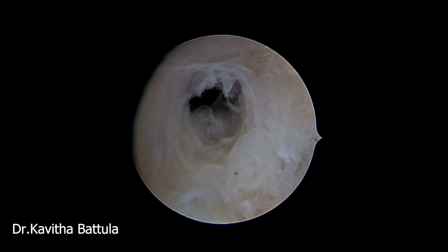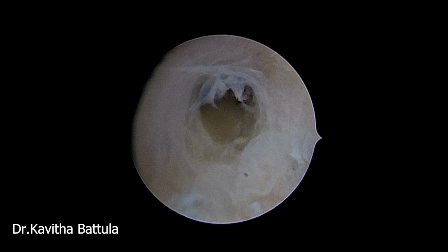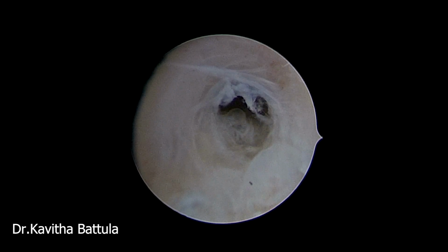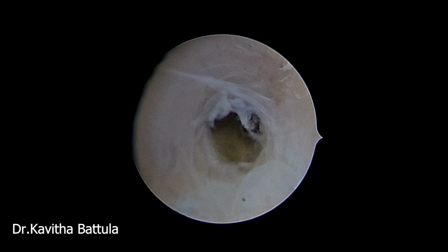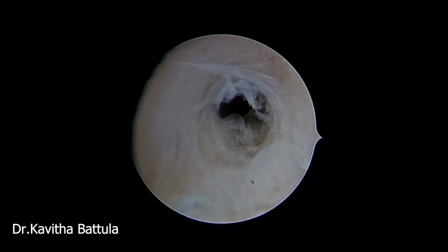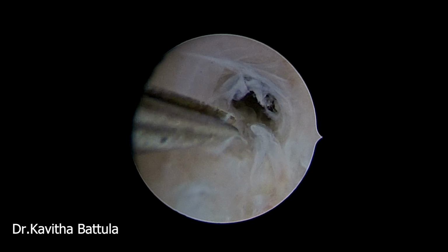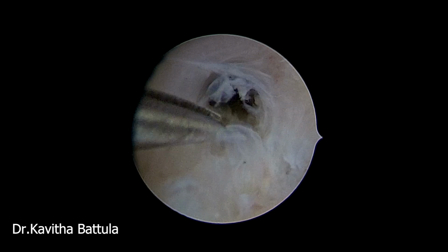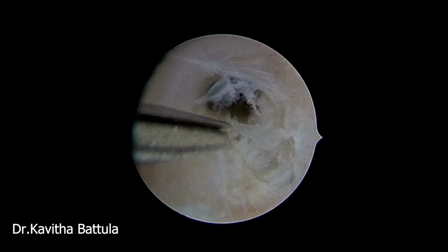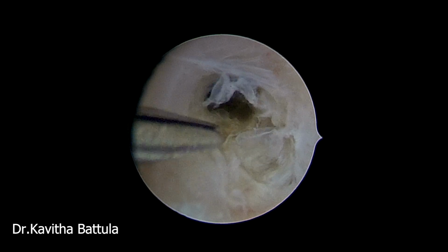So here we have incised, and then we can see the fluid coming out and going in, the thick brownish fluid in the uterine cavity coming out. So we can know that that side is the uterine cavity. And once we incise and dilate it, we can go inside and see further, both ostia. That confirms that that is the uterine cavity and the internal os.